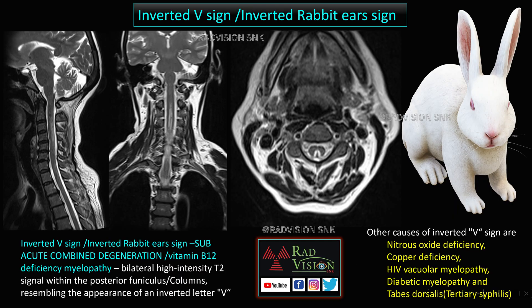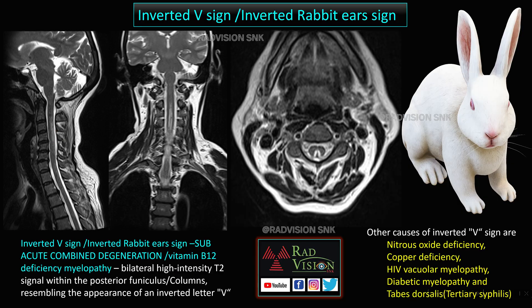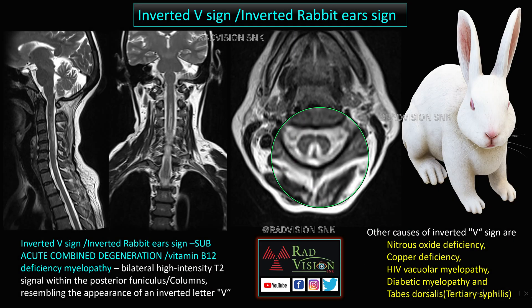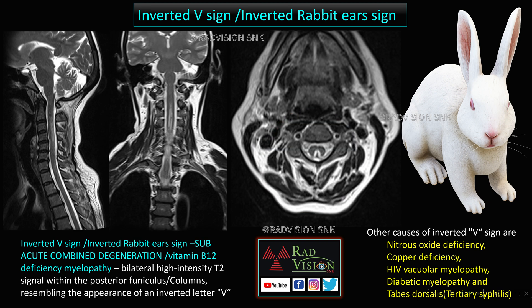Next case — guess the sign and diagnosis. Here you can see hyperintense signal in the spinal cord predominantly posteriorly. This is called the inverted V sign or inverted rabbit ear sign — bilateral hyperintense T2 weighted signal noted in the posterior funiculus. These are typically noted in the posterior funiculus or posterior columns, and the appearance resembles the inverted letter V.